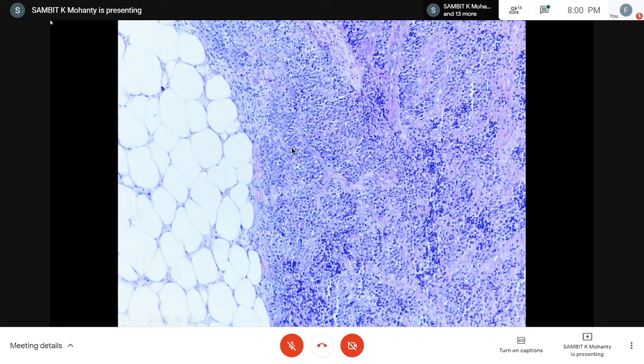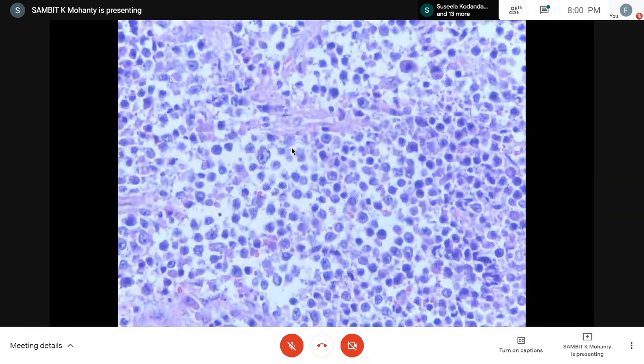We have these blue areas with small nodules. There are some residual follicles, some focal, and we have these pale cells. There are some areas with a pseudoalveolar-like pattern. In some areas the cells are packeting. They have prominent nucleoli.